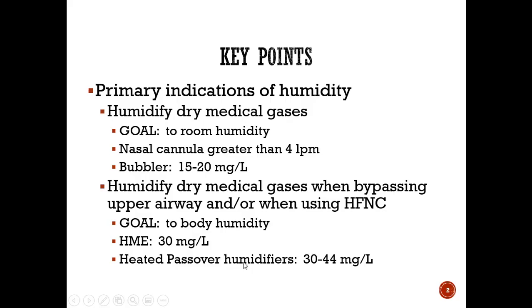So I'll explain this, and then you guys can look at that grid and start to make flashcards so you can start to differentiate which one you would pick. Really quick, to circle back to our previous lecture about humidity, you have two primary indications that you're looking at. One is to humidify dry medical gases with the goal of room humidity.